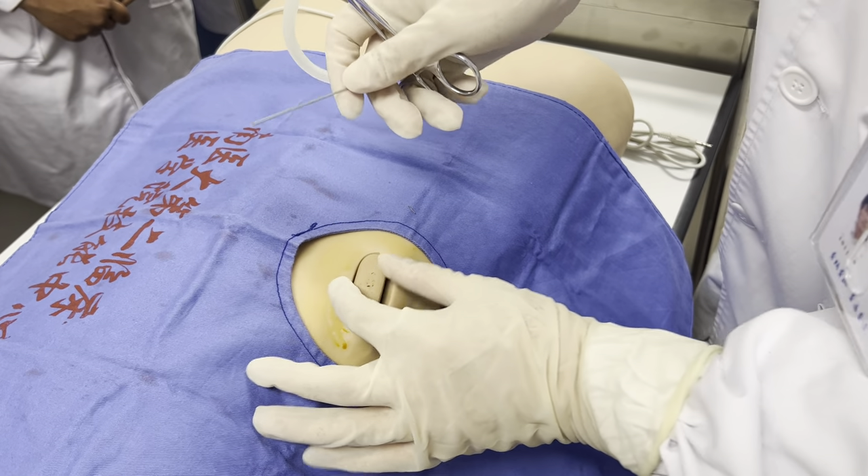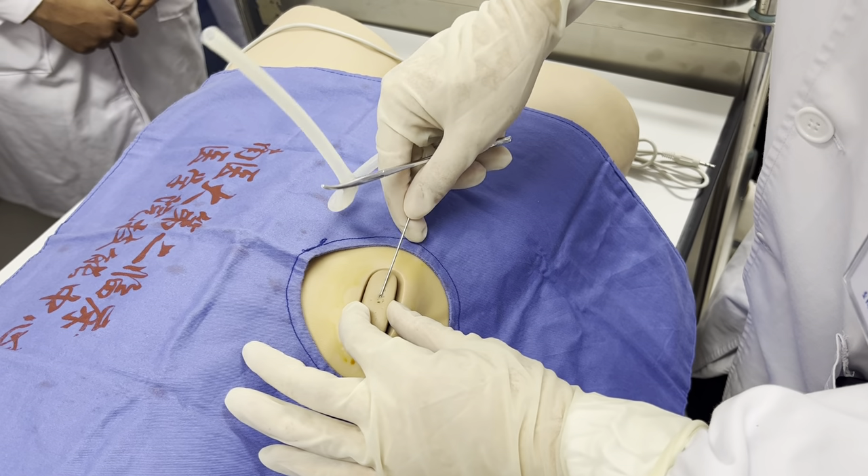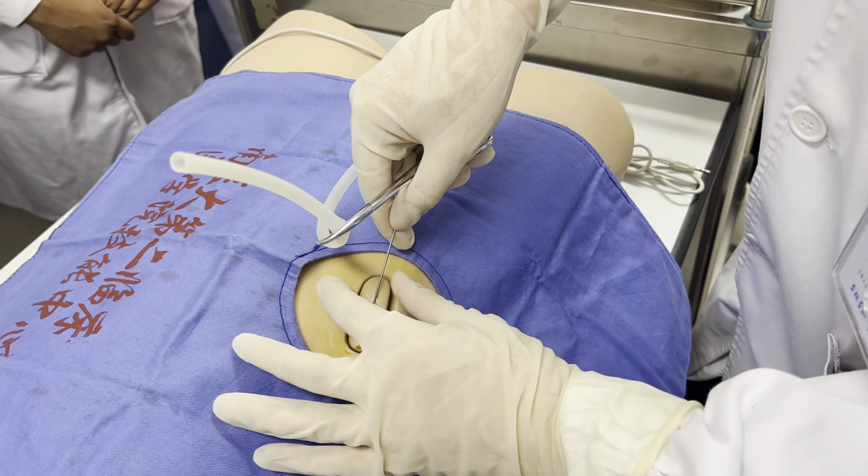When you remove the needle, there may be leakage. But if you use the angled approach like this, we can avoid it.